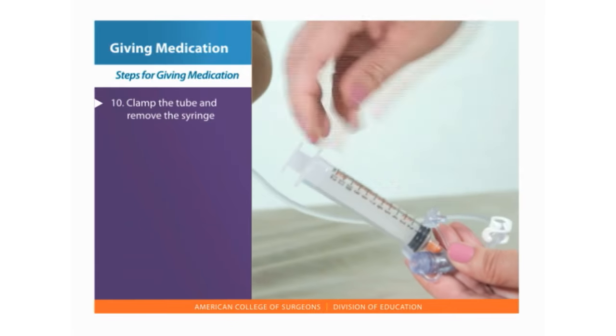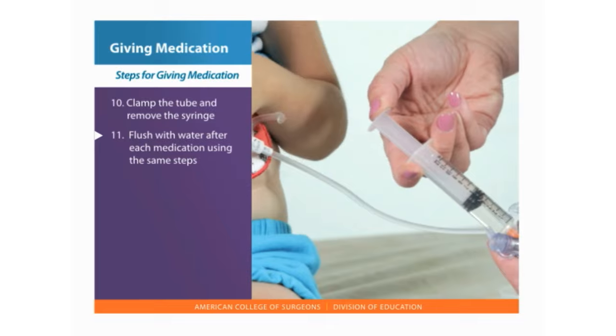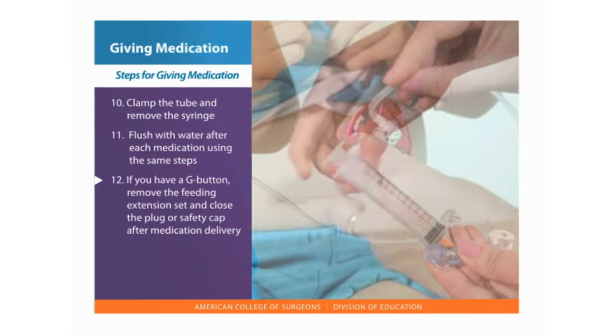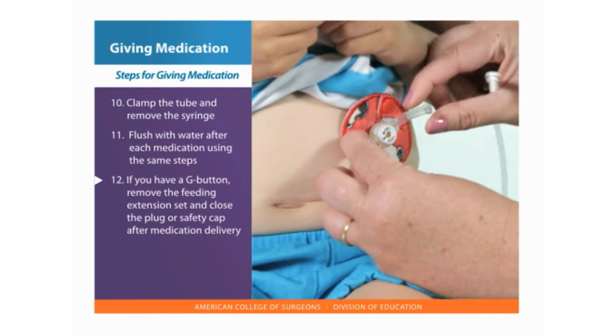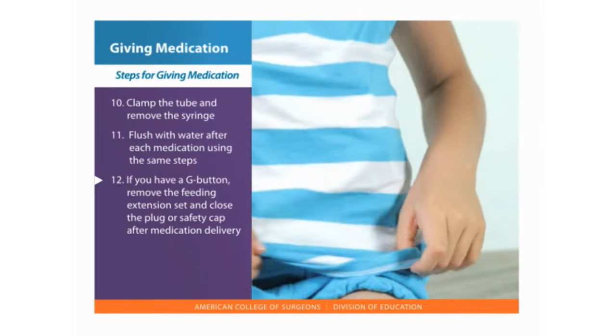10. Clamp and remove the syringe. 11. Flush with water after each medication using the same steps. 12. If you have a G button, remove the feeding extension set and close the plug or safety cap at the end of the button after medication delivery.